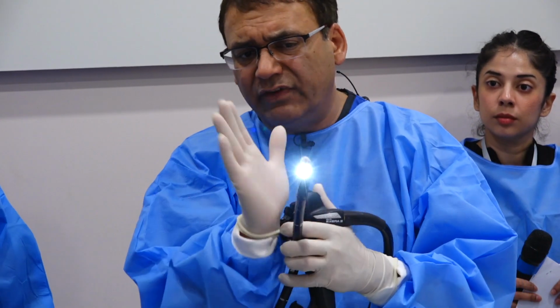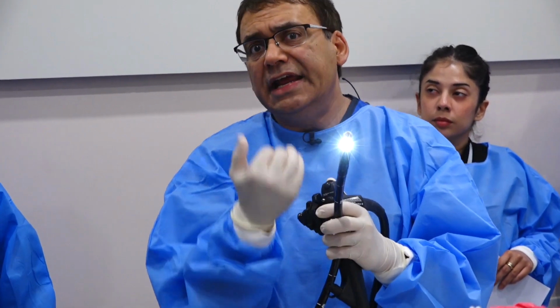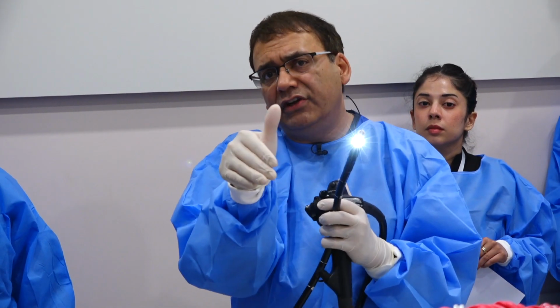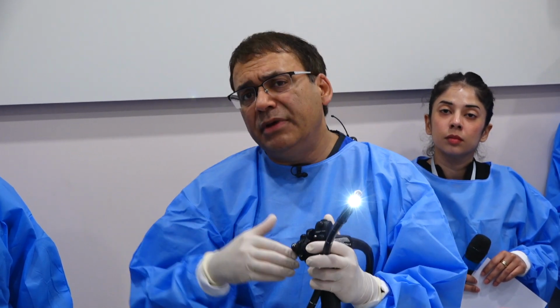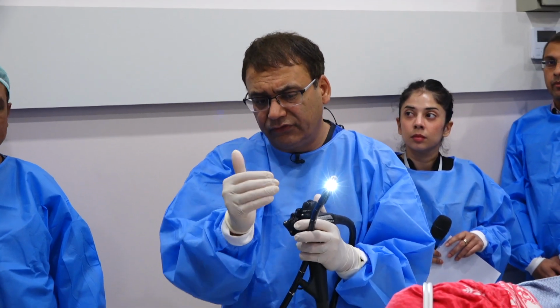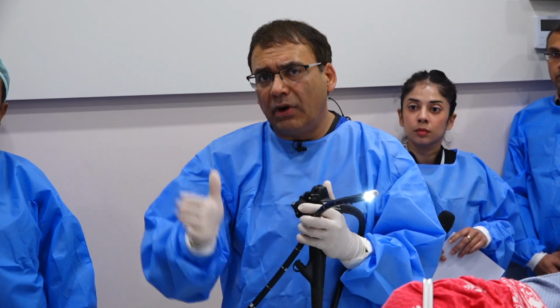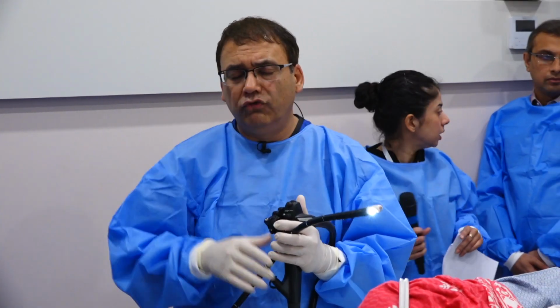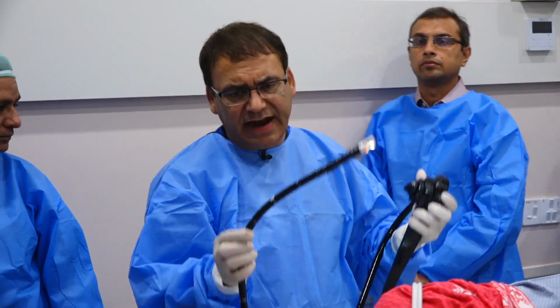The reason for that is when the transducer gets to the back of the throat, if I'm holding too close and it gets to the oropharyngeal area, and to pass the upper esophageal sphincter I have to move my hand back to hold the scope, then the patient is going to be more irritated and you will have a problem intubating the upper esophageal sphincter. And if I'm holding it from too far, that also is a problem because I will not have control of the scope and it would be too floppy to get through that. So holding somewhere between 25 and 30.